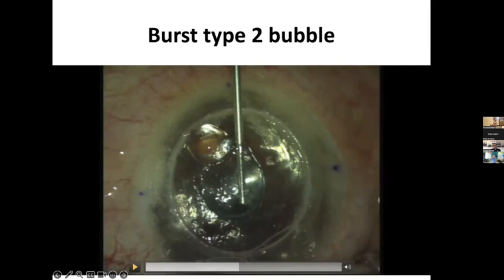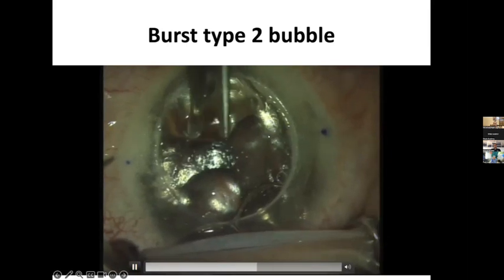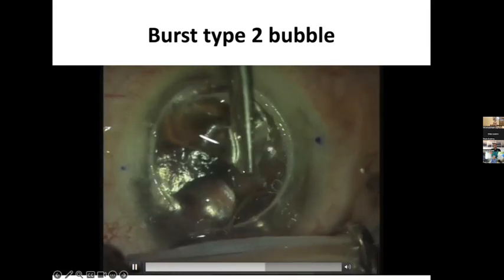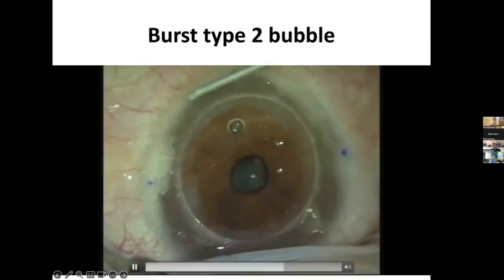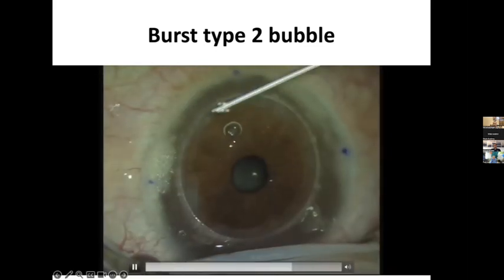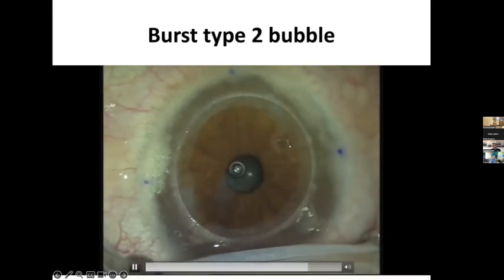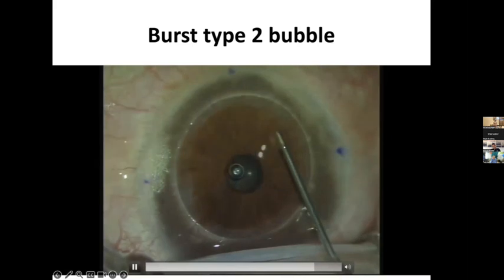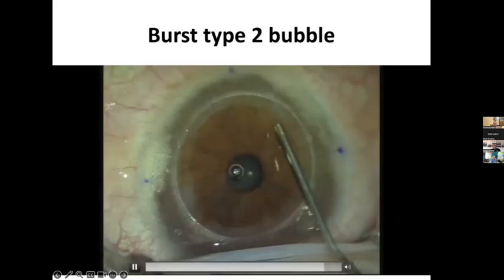So now I'm trying to dissect the remaining stroma. I know that there is a perforation here, but when I introduced the scissor, I had a burst bubble again. So I'm having now 2 perforations, and Descemet membrane is, as you can see, there is a large perforation here and another perforation in this area. So this is the burst type 2 bubble.